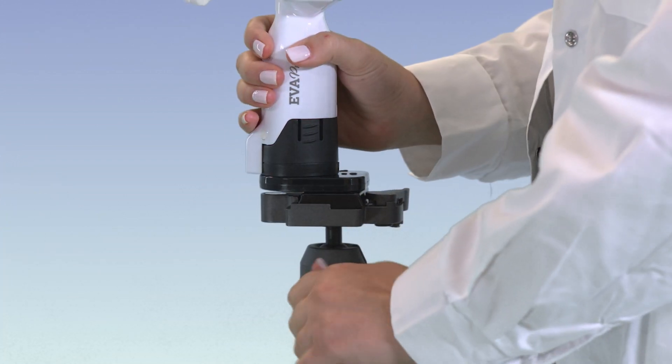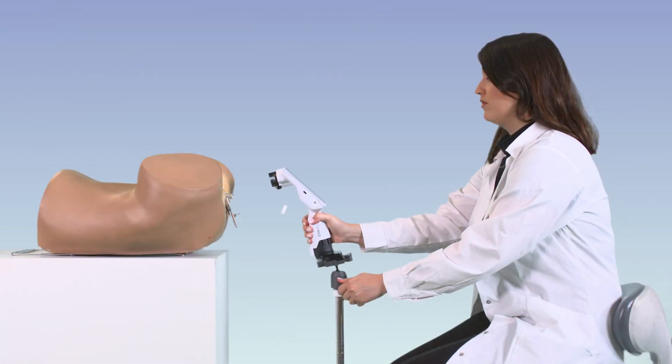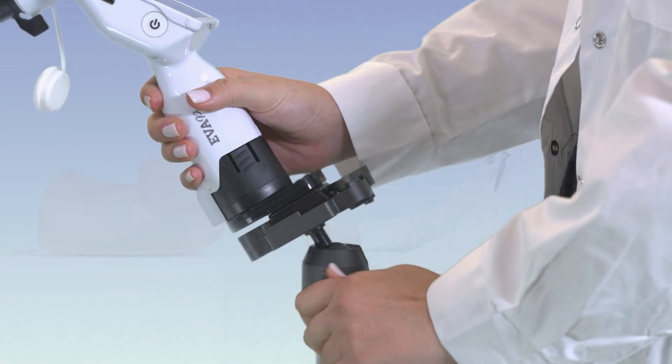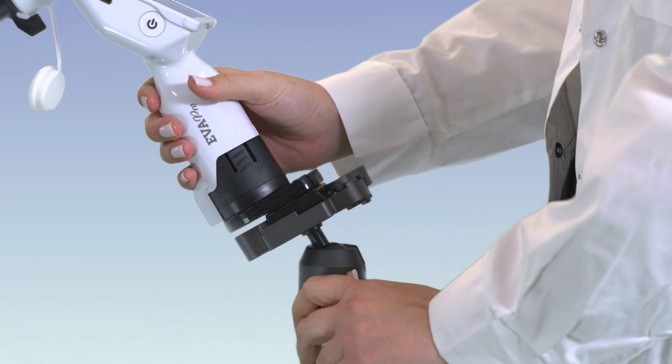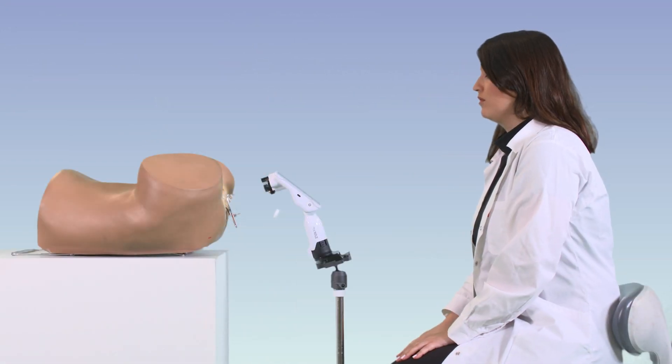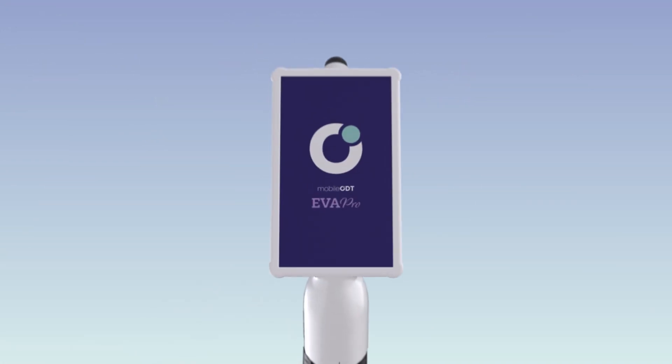Adjust the device position on the stand to achieve the best cervix visibility. Now you are ready to use your EVA-PRO colposcope.